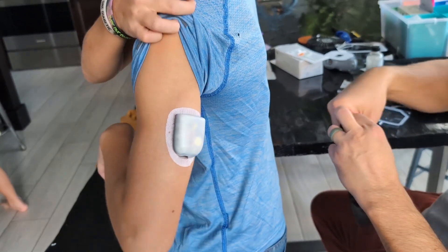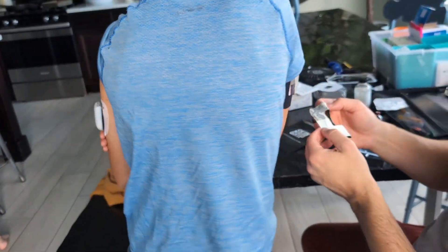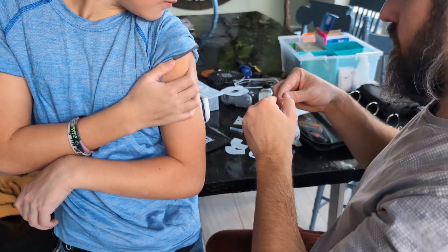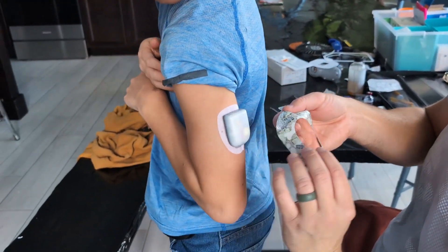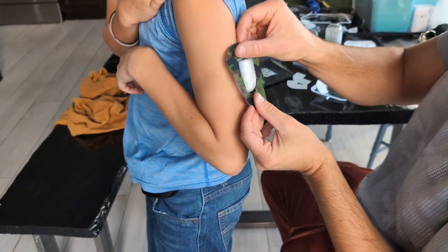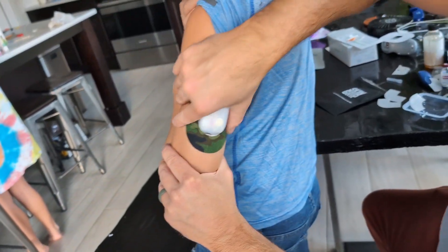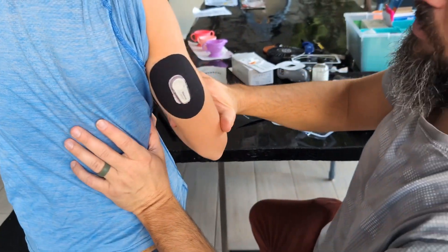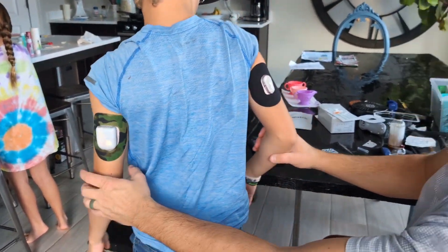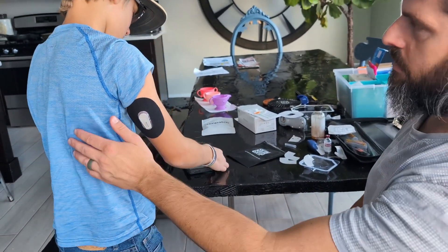We're going to go ahead and do this skin grip — this is an overlay patch that goes over and around. Same concept as the Dexcom one. Now this will communicate with his pod. The Dexcom will give readings to the phone, it'll automatically give him some insulin, and also when he's going to eat, he puts in how many carbs he's going to have and it'll give him his insulin.